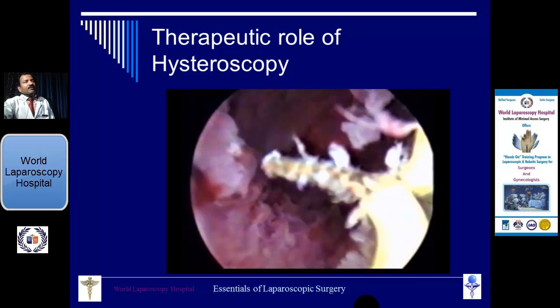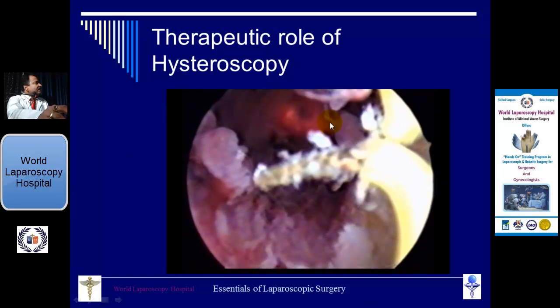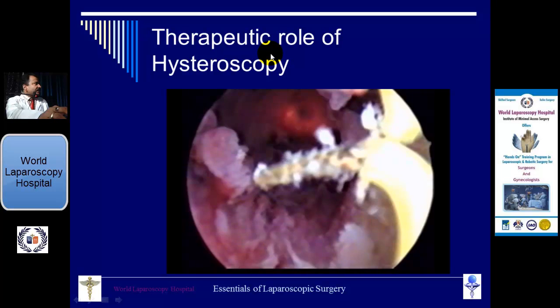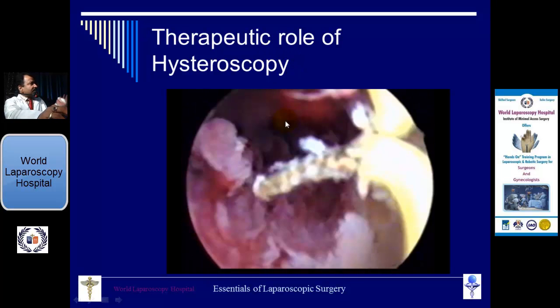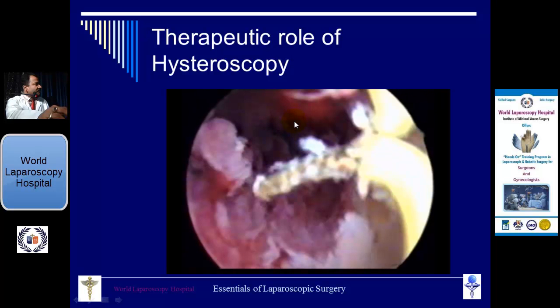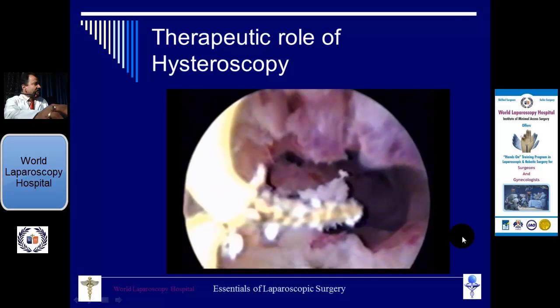Due to the pressure of the fluid, automatically the two sides will go away from each other. This is transillumination. Can you see the light? This is the light coming from the top. This is the laparoscopic light, and this video has this problem, that whenever I start, it goes again, there is some hitch there, I don't know what it is, but thank God it started again.